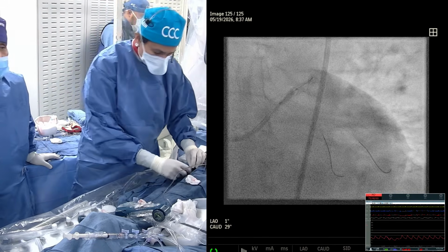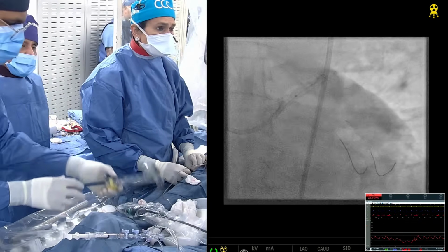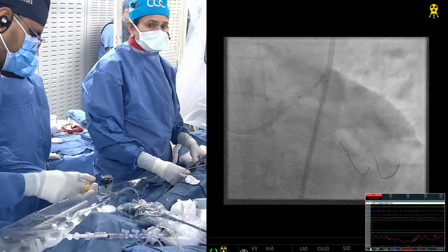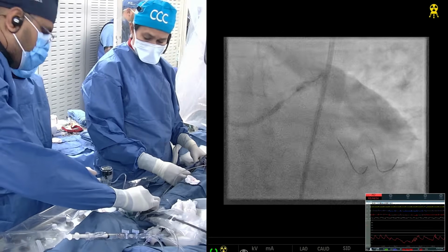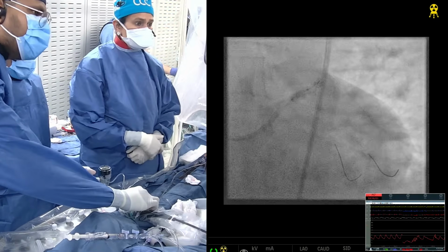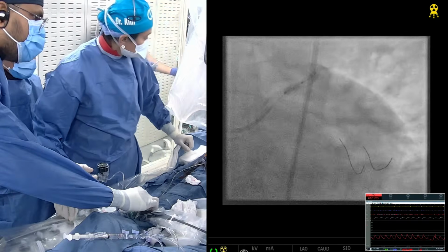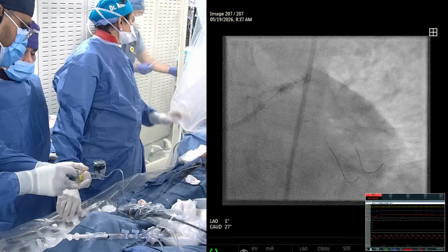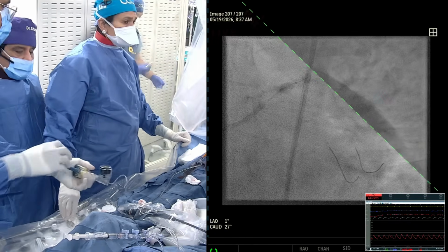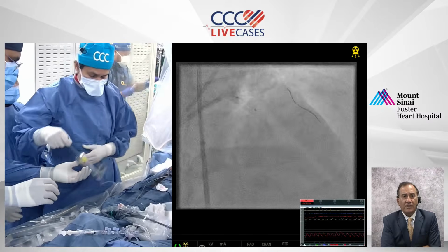The blood pressure does go down because we are inflating in the left main, and that is precisely what all the companies are working on: can you cut this ischemic inflation time down to 5 seconds rather than 10 seconds? Has anybody even thought about creating some kind of perfusion balloon and mounting IVL on that?